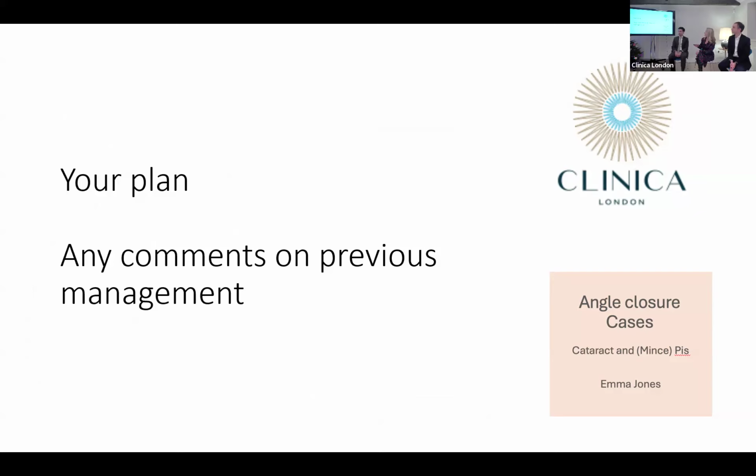So I think we talked about the iridoplasty a little bit. It's still used in some cases. There's a particular condition called plateau iris. It's very, very uncommon, but it's a particular type of narrow angles. You can see it when you put on the gonio lens, and you can see it on an anterior segment OCT. The diagnosis of plateau iris is made after they've had a PI. Some people can look like they've got it, but to warrant doing iridoplasty, they'd have to still have the narrow angle and that particular configuration after a PI.